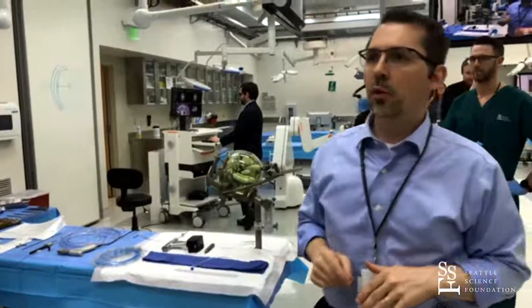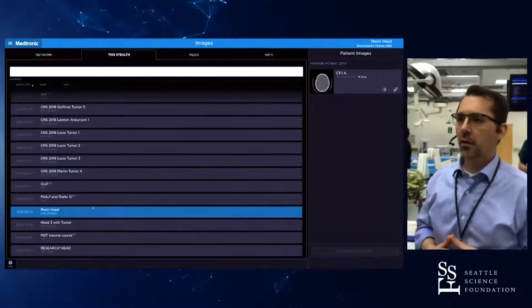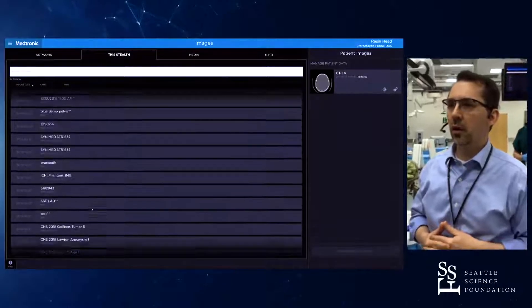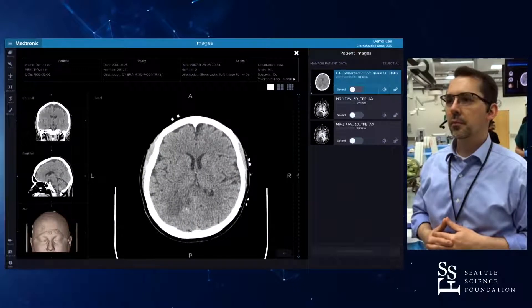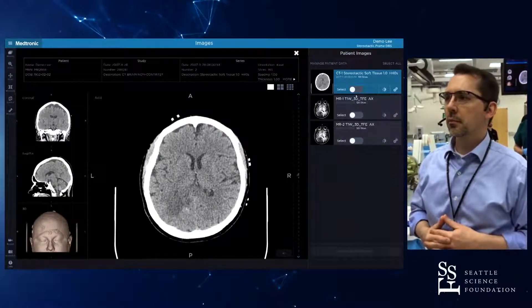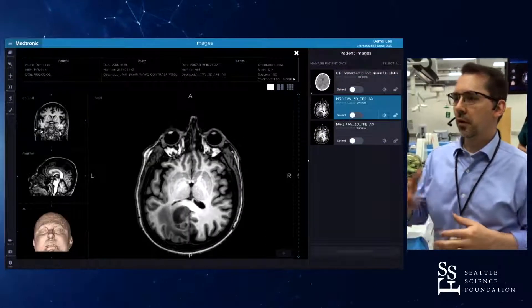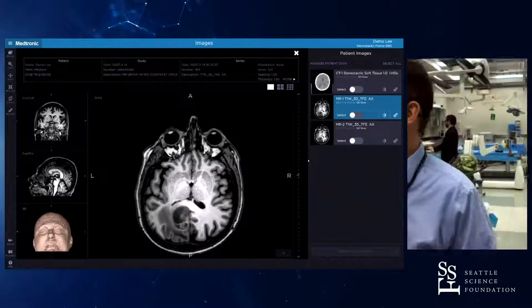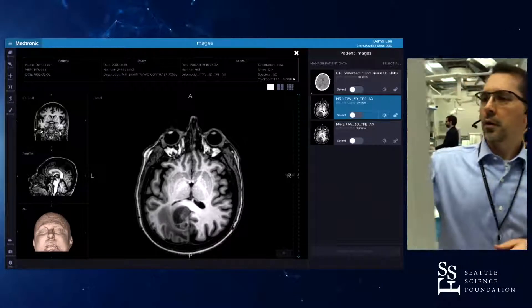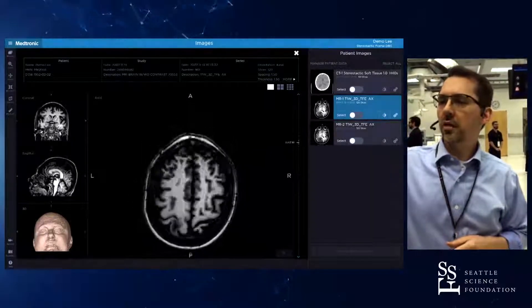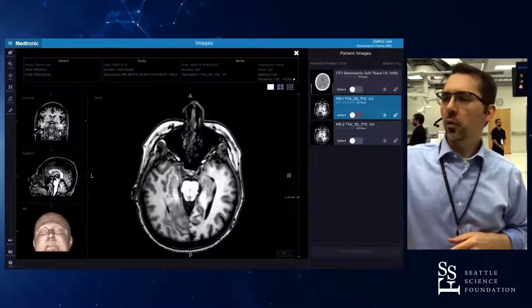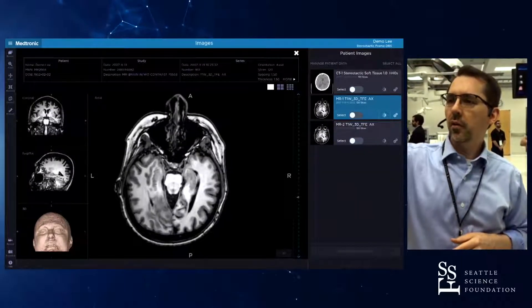We're going to pull up initially an MRI scan on the Medtronic Stealth station, and I'll show you how to plan a trajectory for amygdala hippocampotomy. There's a tumor on this as well, but we're going to ignore that for the moment. What we can see here is an axial T1 MRI scan. Let's assume that we're going to target the left amygdala hippocampus.